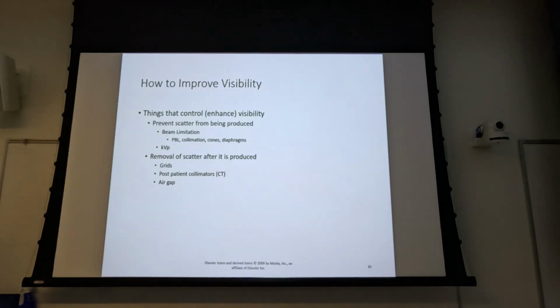People are just not taking the time to adjust the collimation and just sticking the anatomy on the image receptor and blasting away. We had that problem before, and they introduced PBL to make sure that the field size was never larger than the image receptor size, which is one of your cardinal rules of collimation. Never, ever larger than the image receptor size, and it should be collimated to the part.